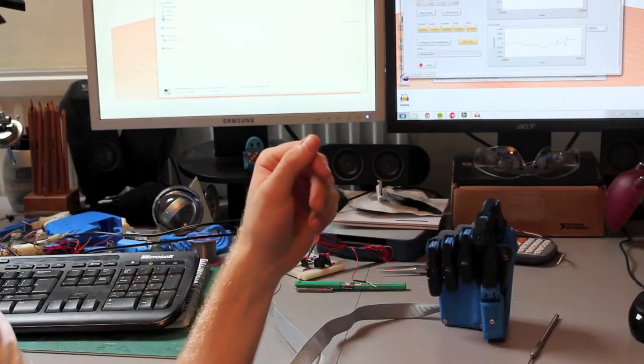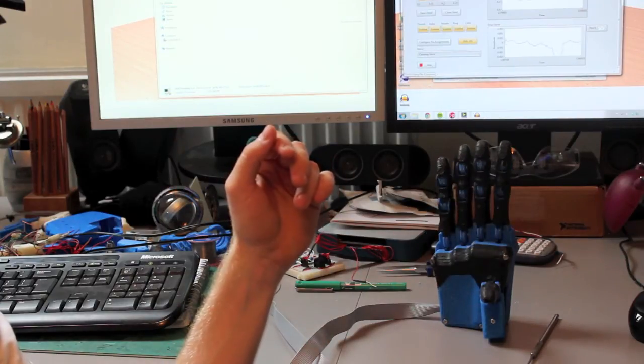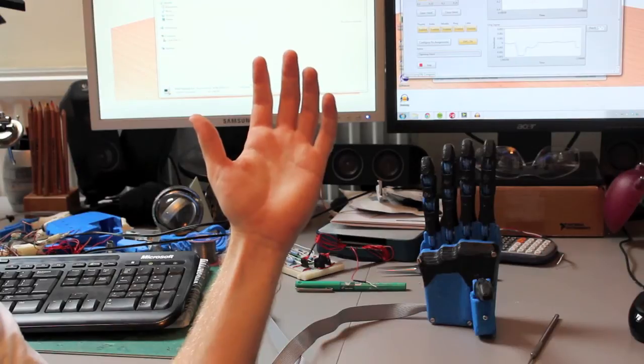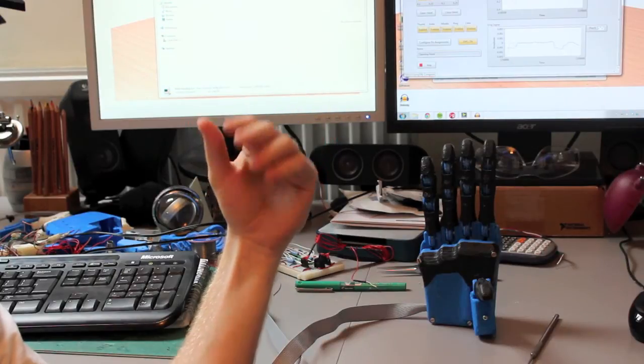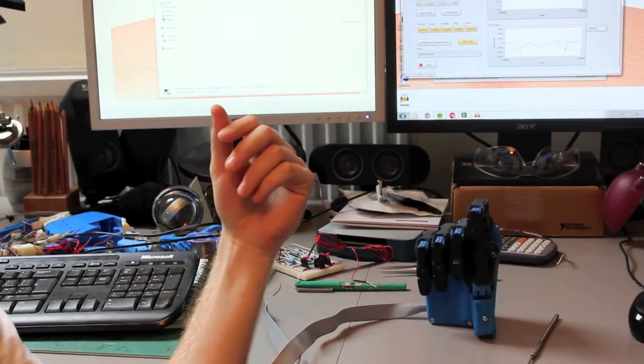Now the muscles that I'm using here are typically ones that would remain in somebody's forearm even after their hand had been amputated.